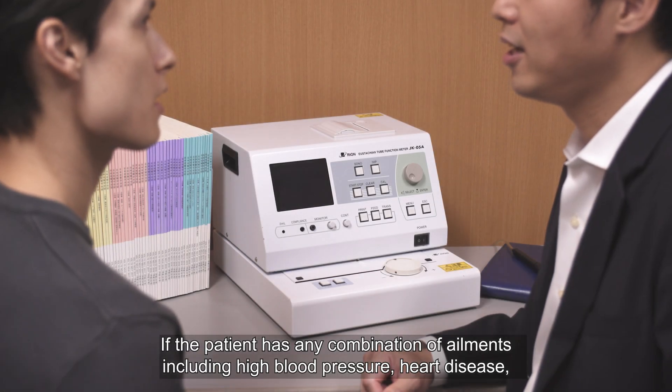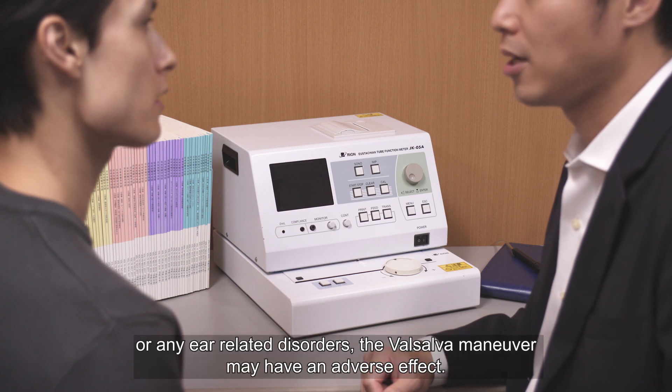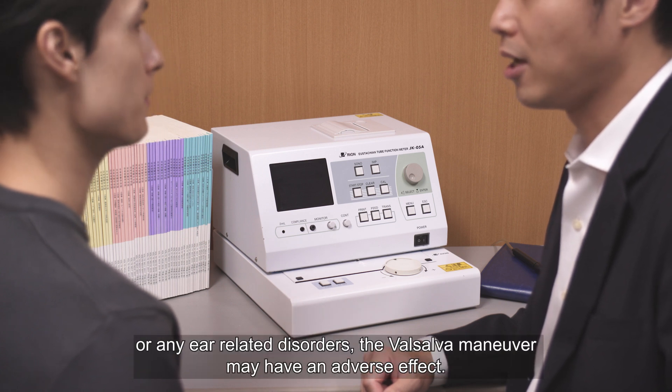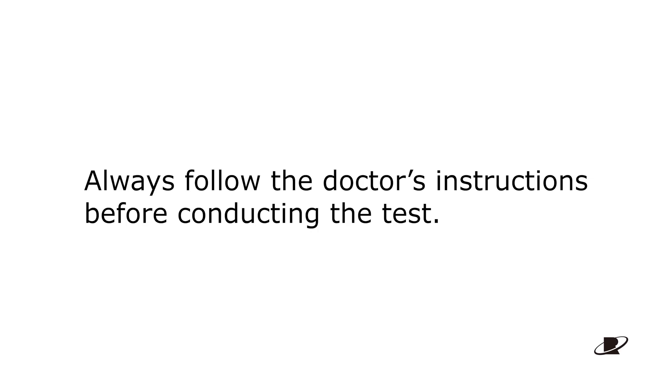If the patient has any combination of ailments including high blood pressure, heart disease, or any ear-related disorders, the Valsalva manoeuvre may have an adverse effect. Always ensure that you follow the doctor's instructions before conducting the test.